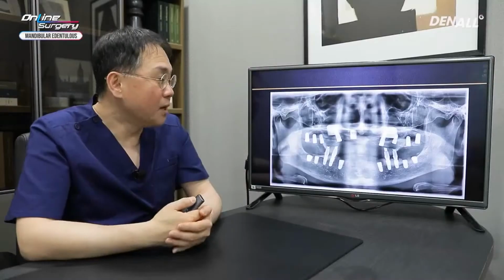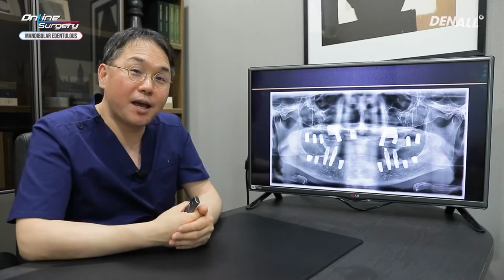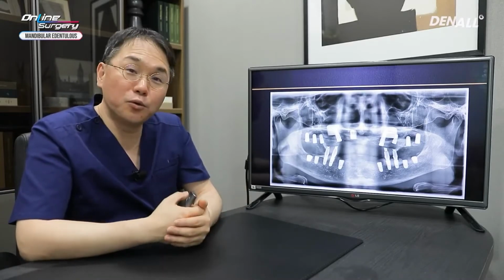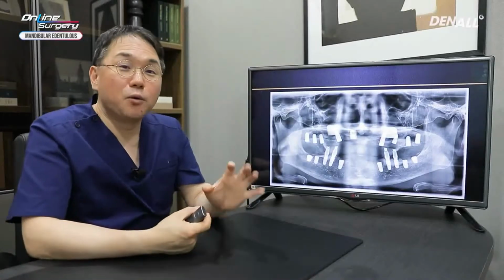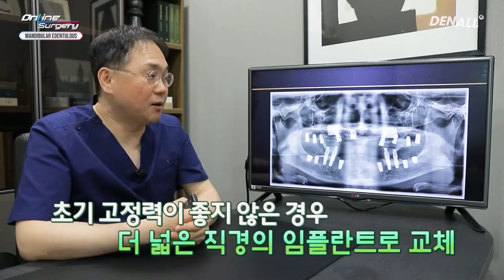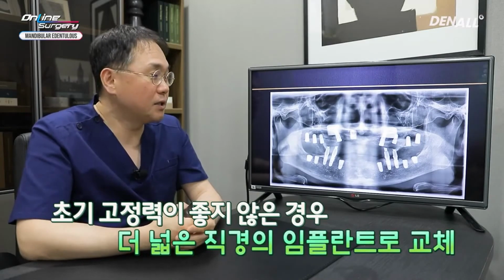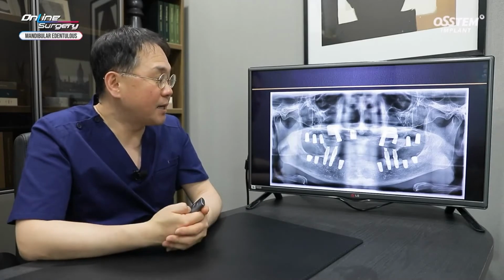As shown, when we first planned, I planned for placing a 5.0 by 8.5 implant on number 7 on both sides. However, after surgery, you can see that on the right side, a 7.0 diameter implant is placed, and on the left, number 37, a 6.0 diameter implant was placed. As shown in the clip, if you place a 5.0 implant and if stability is not good, you can change immediately to an ultra wide diameter 6.0 or 7.0, and that'll lead to better results. This was how it was placed.